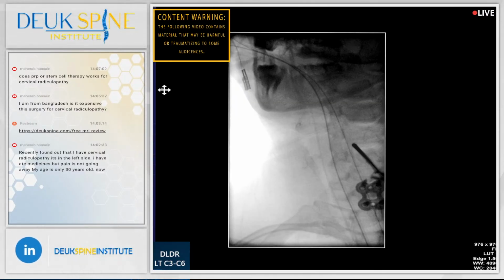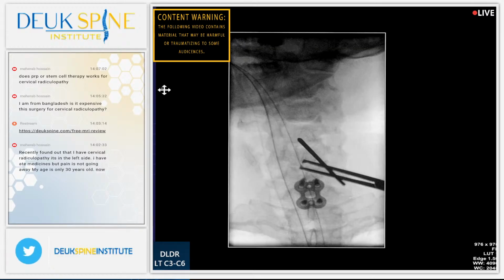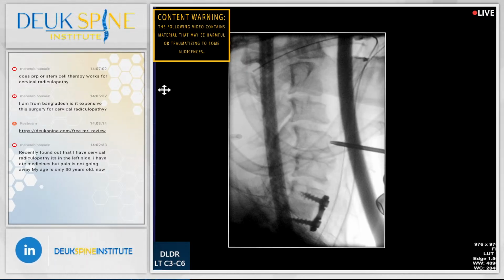Don't take a shot. I should be more centered there. And shot. That's perfect. I need to be a little bit more centered. Maybe right there. Hold on. Shot. That's perfect. Lateral. So I'm going to slide up to the last disc and go in. And this is going to be the number 3-4. Okay, very good. So I'll slide up.